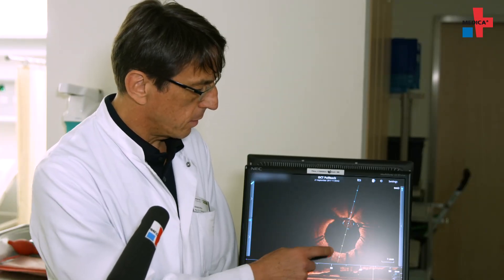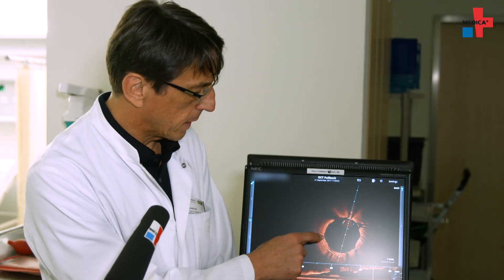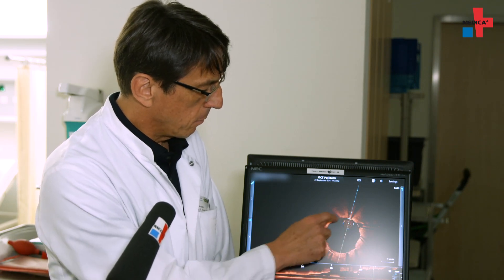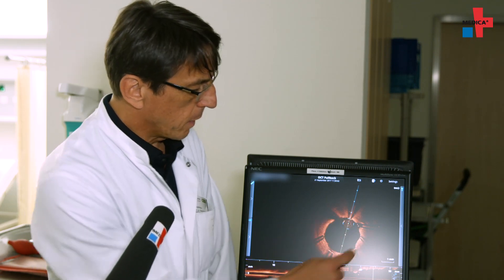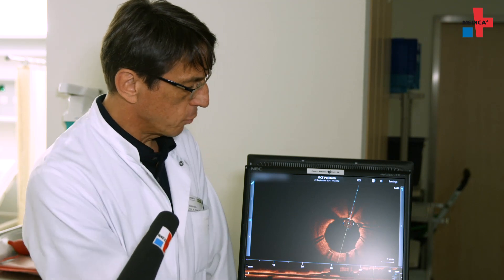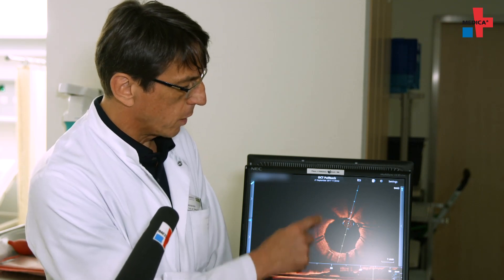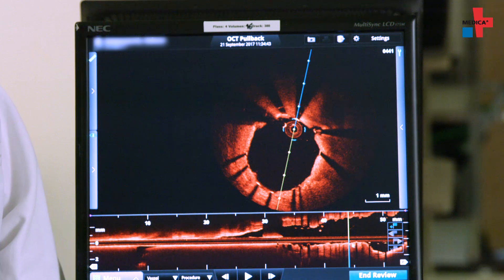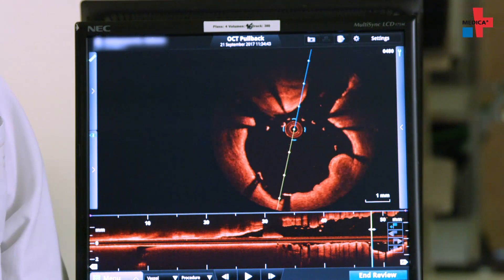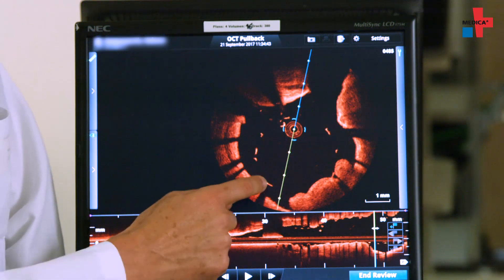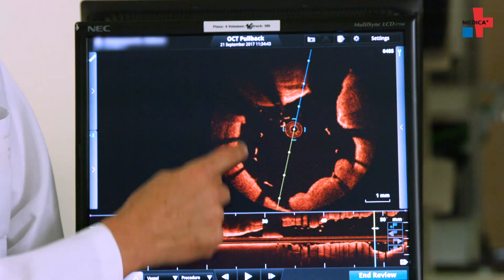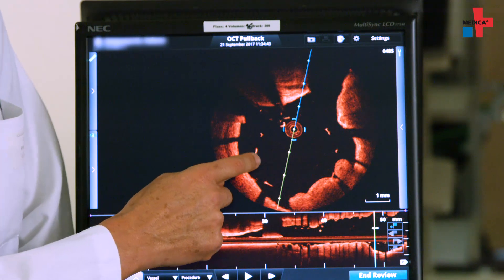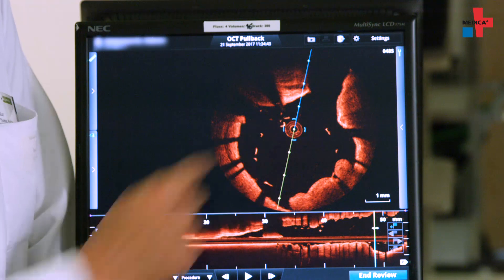Here you can see OCT after a stent implantation. The stent is recognizable by the tiny yellow light spots with a black sonic shadow. The stent fits tightly against the wall. Meanwhile, the same stent doesn't fit properly a little farther up — there are still a few millimeters missing. The balloon stent still needs to be stretched and fitted. We would not have been able to detect this without OCT.